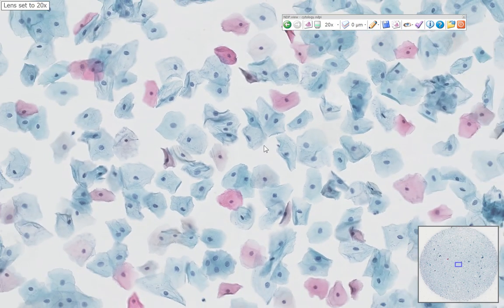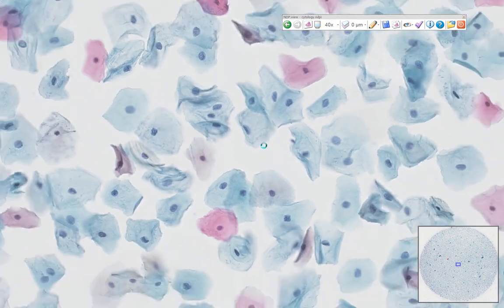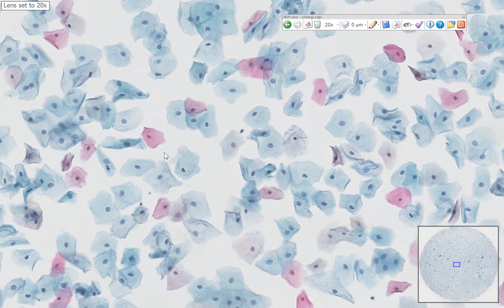Like what I showed you earlier, the way I have it set up, I'll use the mouse wheel to zoom in and out. Some different viewers, because of the 3D nature of cytology and some of the slides, will allow you to save a stack of images using different focus plane layers from the same slide. And the purpose of this is to simulate focusing up and down.